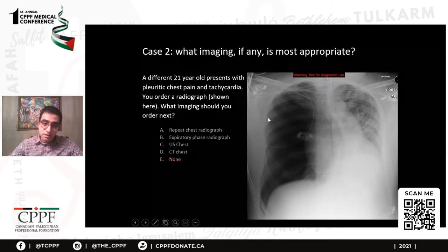But more importantly, we're noticing that the entire mediastinum, so you see this is the midpoint of the spine. These are the spinous processes overlying the vertebral body. So that's the patient's midline. And you can see that the trachea is shifted to the left. You can see the entire heart is shifted to the left. In fact, the entire mediastinum is shifted to the left. We can see that the right diaphragm is pushed inferiorly in comparison to the left.